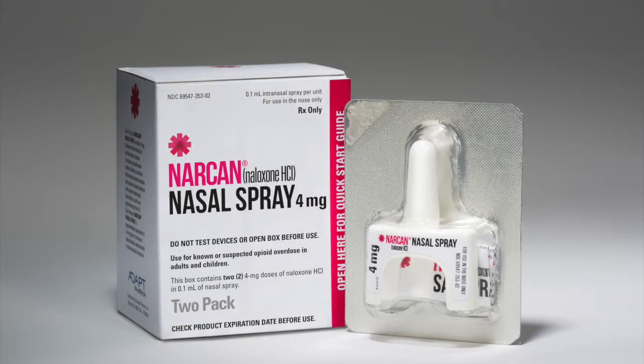Today I'm going to be providing you with a brief training on how to use naloxone in an overdose situation. So first off, this is what naloxone looks like. There are 2 doses of naloxone in each kit, and this is what the actual nozzle looks like.